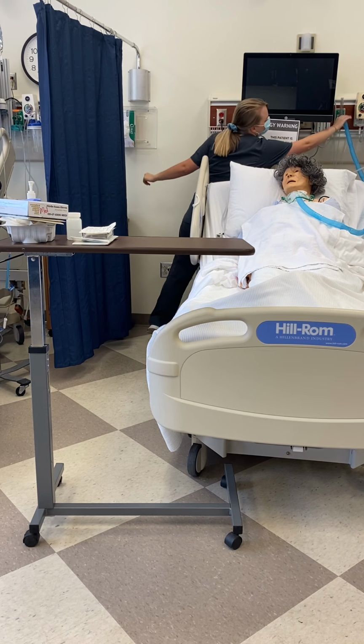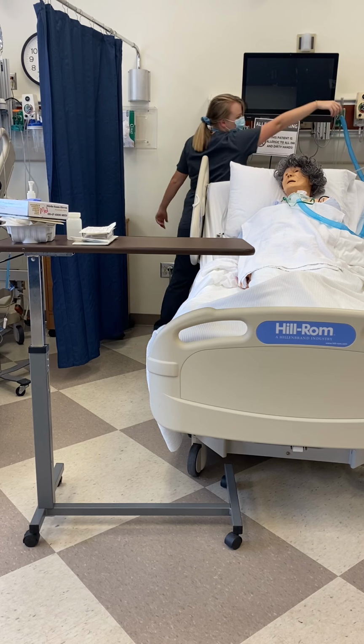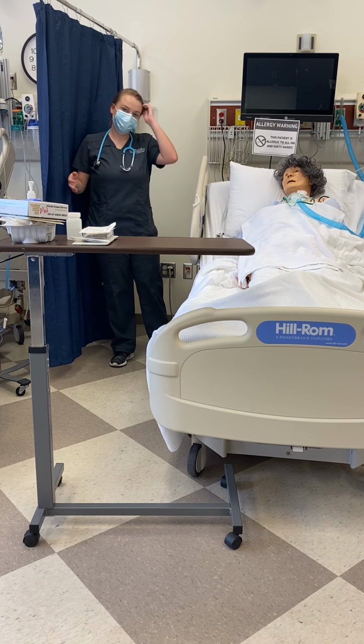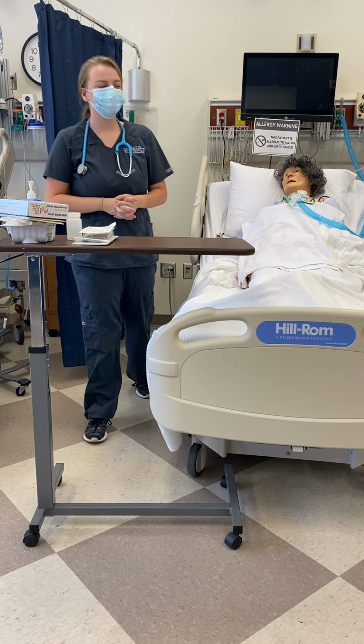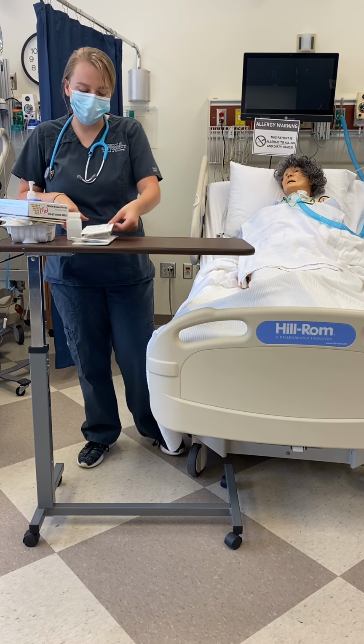I will hyperoxygenate my patient, and I will turn the suction on to continuous, anywhere in the 80 to 120 range. And first I will suction.